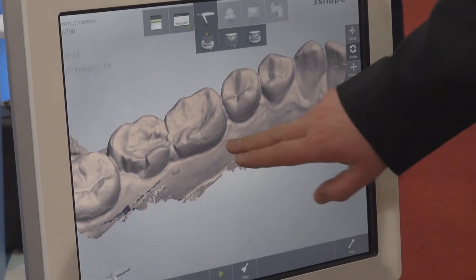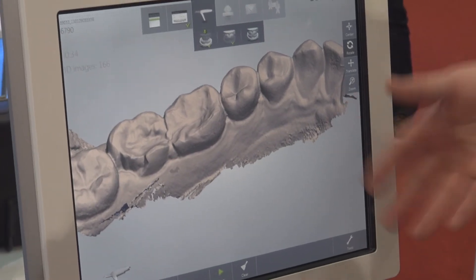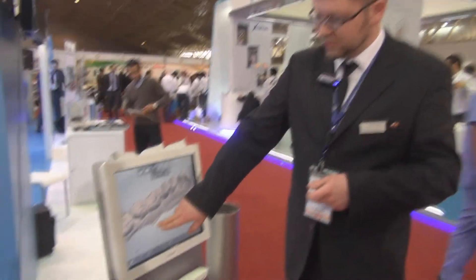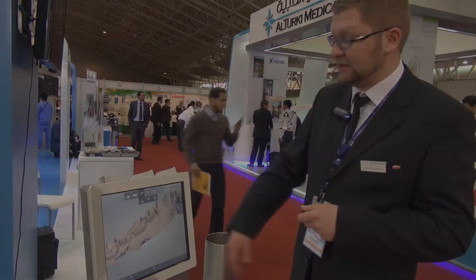This is how, in a similar way, you'll be able to detect the correct margin line. Sometimes it might be necessary to use a retraction cord to see the margin correctly all the way around, but it should be quite easily detectable for both you and a dental technician.